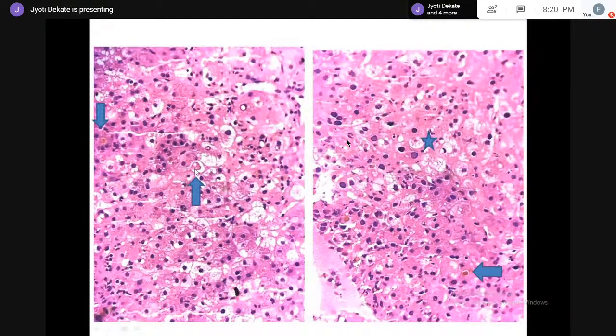And here we can see some scattered apoptotic bodies, and there is significant cholestasis, both canalicular as well as intrahepatocytic. Also, in addition, what we notice here are abnormal nuclei which look distinct from the adjacent nuclei. In what sense? There appears to be some margination of the nuclear chromatin, there is some multinucleation, there is some molding of the nuclei, and so is the bilirubinostasis as we see here.